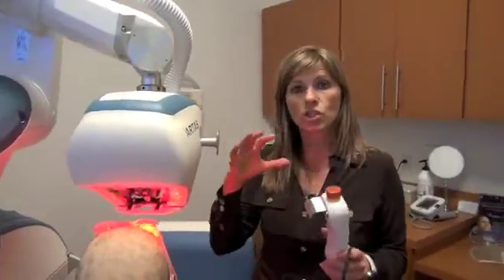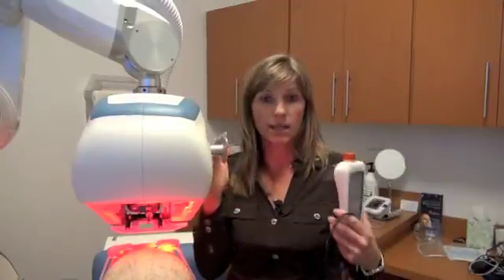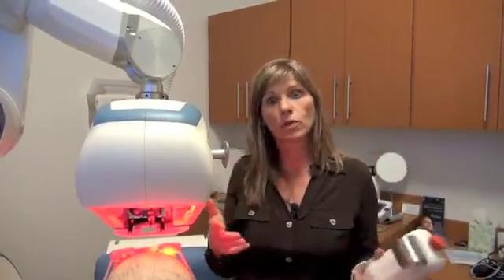It's built with safety in mind. At the very beginning, before we even start performing anything or treating a patient, the system goes through verification. If it doesn't pass verification, if all the parts of the system are not working properly, nothing will happen. So it is safe — number one — that at the beginning of every procedure, we go through verification. Then we go through calibration.